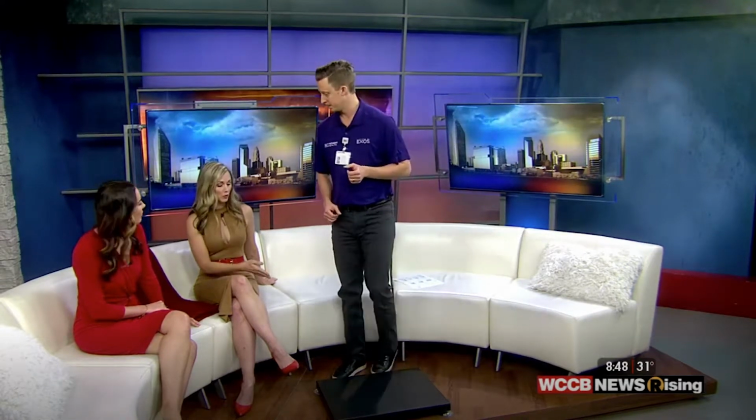And for people who have an injury or maybe can't jump, there are other ways to use the scan, correct, that don't involve an actual launch like you described? Correct. So one of the things that we have done on the rehab side is we've had post-surgical patients come in and we'll measure their balance. Can they stabilize that leg? So if they've had an ACL tear, they come in, they balance, and we can track that progress over the course of 3 to 6 months.